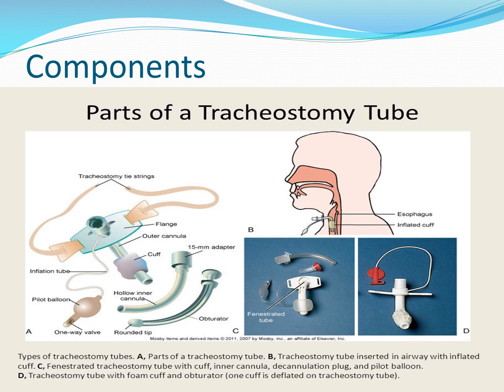And then on the lower right hand portion of this picture, it's showing you a little bit more regarding the actual tubes themselves, instead of a line image, and showing you, for example, one that's fenestrated and where that fenestration is located.